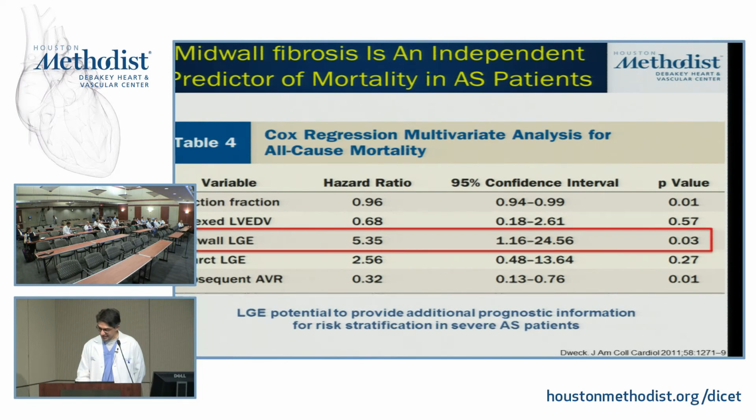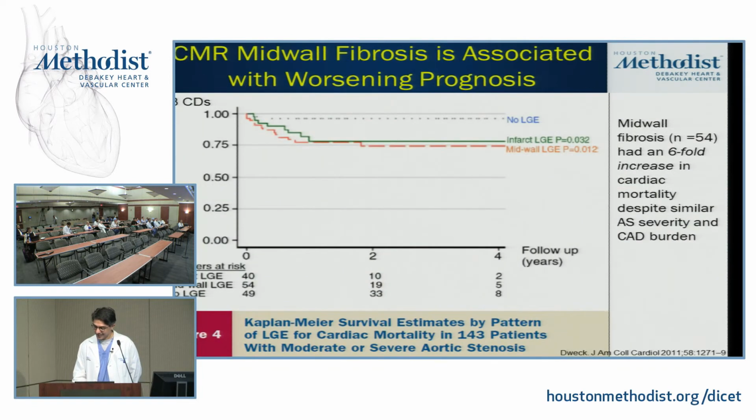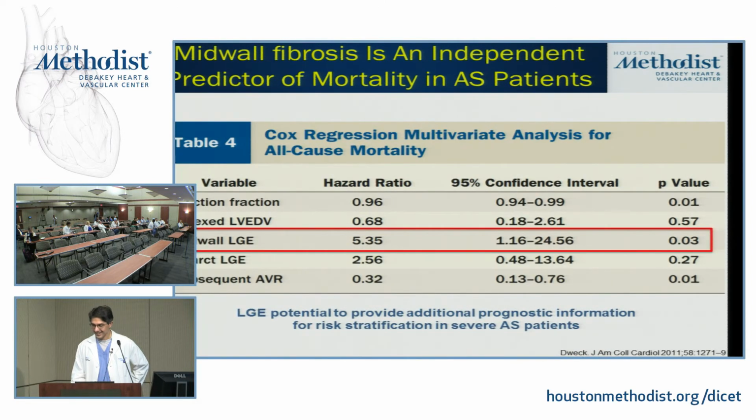These are small studies again. I think we can definitely, 143 patients. I think definitely you're right. With the number of cases we've done here, I think Alpana is working on this. Alpana is going to give us an update next year. Yes. We have over 1,000 patients. All right. For AS, I think close to 2,000.